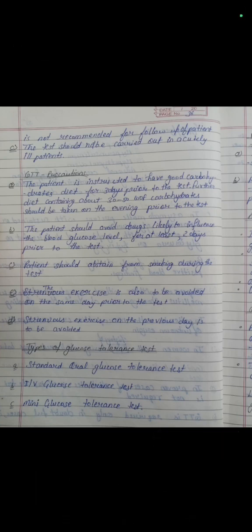Now we will discuss the glucose tolerance test precautions. The patient is instructed to have a good carbohydrate diet for 3 days prior to the test. Further, a diet containing about 30 to 50 grams of carbohydrates should be taken on the evening prior to the test.